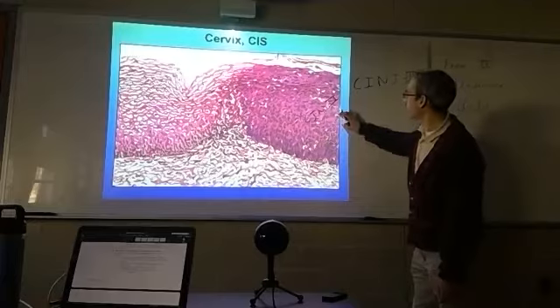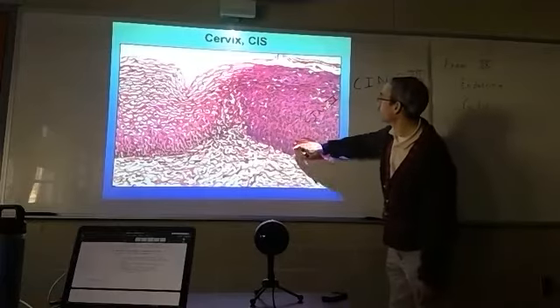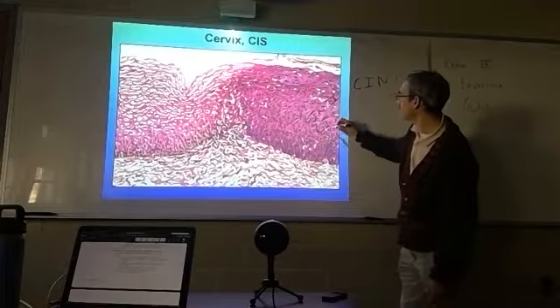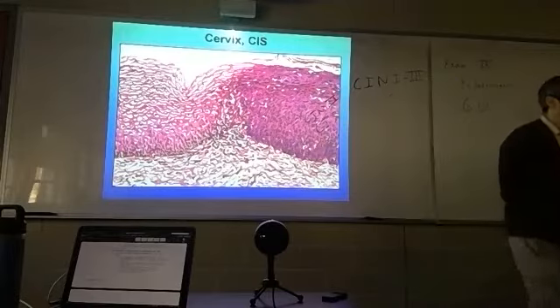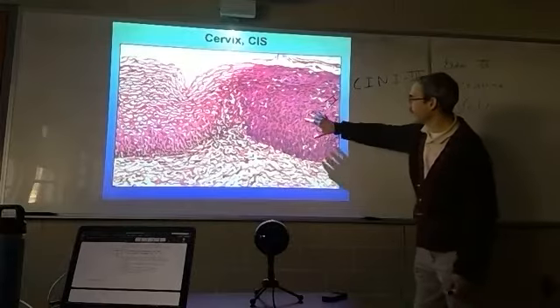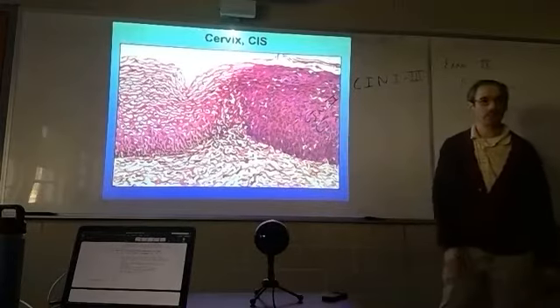Specifically, this severe form of dysplasia is full thickness dysplasia. So we can go one more and describe this as carcinoma in situ, CIS, carcinoma in situ. This is the worst form of dysplasia possible. This is basically cancer just before it becomes cancer.